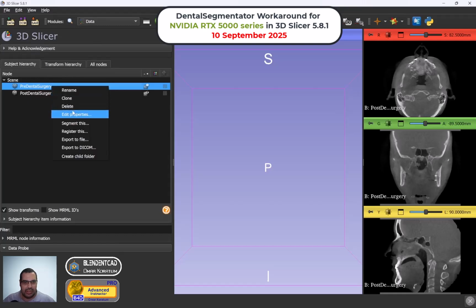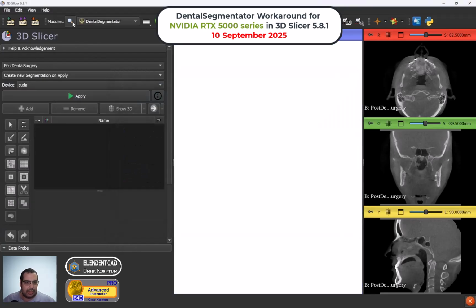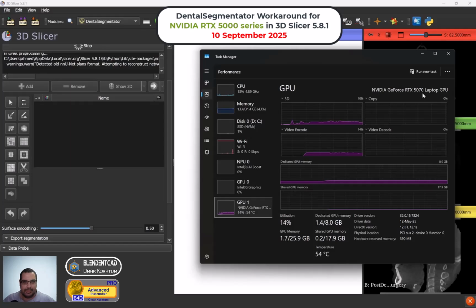I'm just going to delete that. We need one only. And then I'm now going to the DentalSegmentator. Now, as you can see, I will just press on apply and I will show you the task manager to show you I'm using NVIDIA RTX 5070. Let's just wait a little bit until the error pops up.